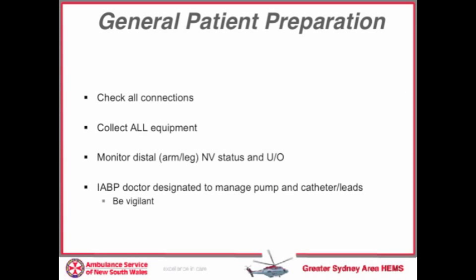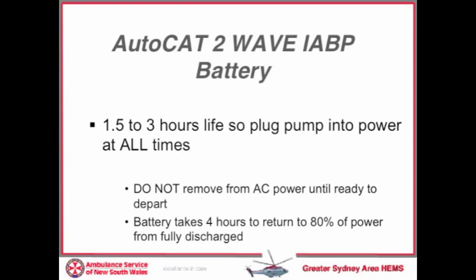As always, it is the doctor's role who's managing the balloon pump to be vigilant and manage not only the pump but also the catheter and the leads. Although the literature will say that there's up to 3 hours of battery life, in real terms this may be as little as 45 minutes, so please keep the balloon pump plugged in on AC power at all times.